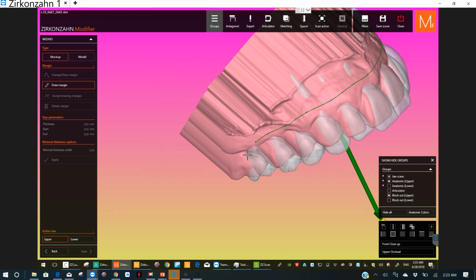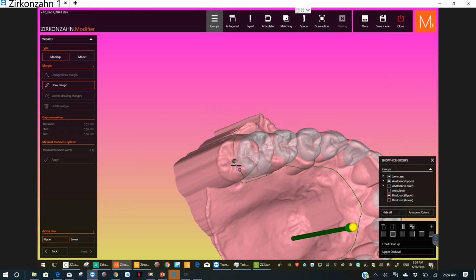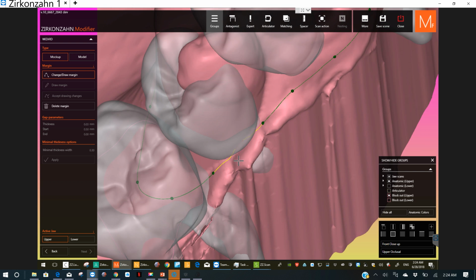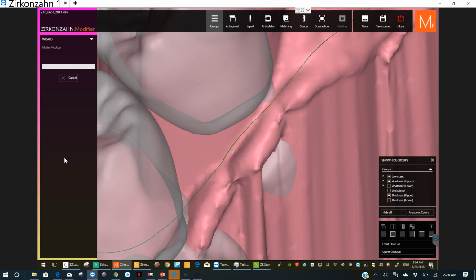When you're drawing these little margins around, it's nice to use that wheel click to center everything, because you'll find that your model starts to drift off the screen. Double click to finish, and we did have one little yellow spot there that I gotta take care of. There. Aha, that did it. So submit changes, apply, and I think it's gonna make our appliances now.